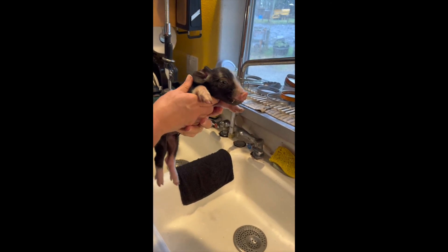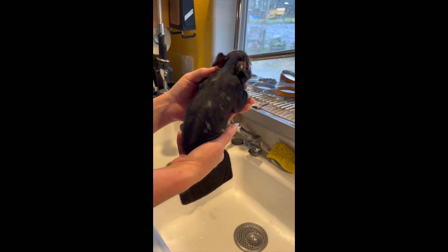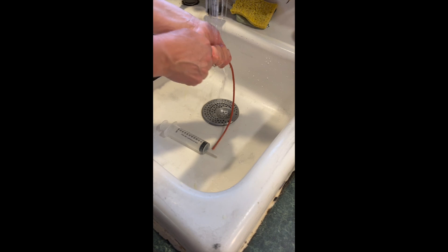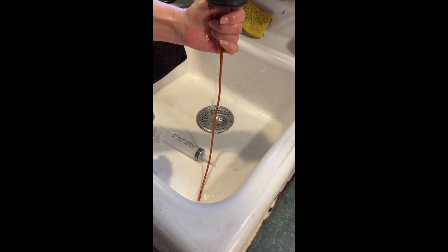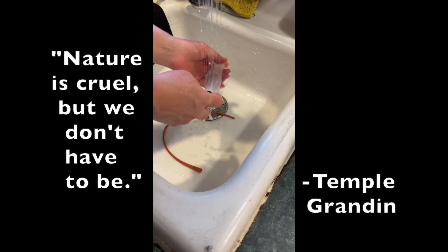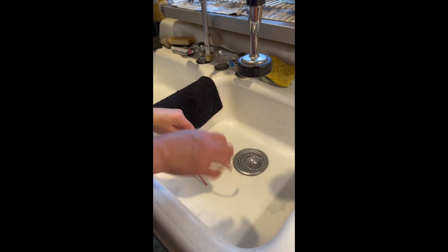Hopefully this piggy gets strong enough to start nursing on its own and feed itself. Make sure when you're done that you get everything nice and clean, rinsed out, and put away so you can use it again two hours later. That's pretty much it — it's a lot of work and not always successful. But if you're like me, you can't just watch them die. You're going to spend a lot of sleepless nights and maybe you'll save a few along the way. Hopefully you do — have a good one, bye bye.